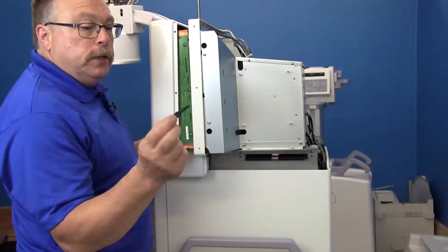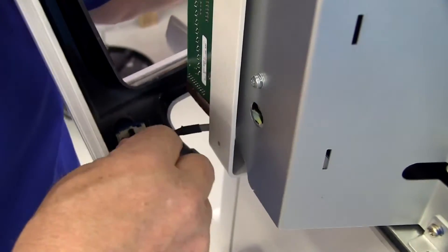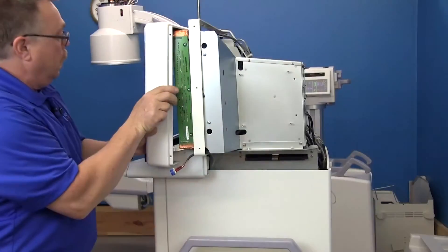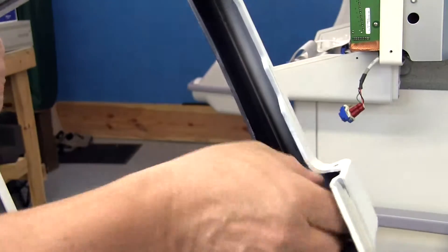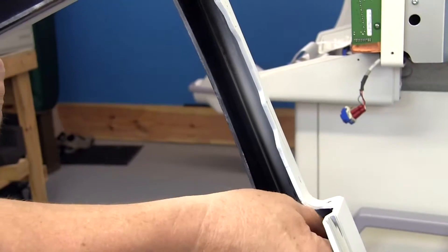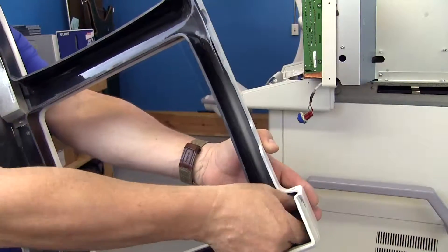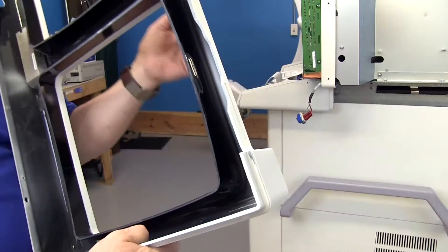You can use an extraction tool because you have to separate the harness from the switch itself — it comes right off. Now you can just pull this straight off. On the back side we have a retaining ring that actually screws onto the switch itself. Just grasp that and unscrew it. Sometimes this can be really tight so you might need to use a pair of pliers.